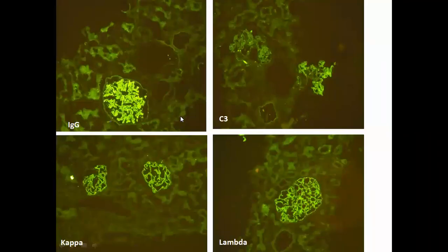And in immunofluorescence, what you will find is very strong IgG. There will be C3, which will not be as strong as IgG. It could be trace. You can just see this. This glomerulus is absolutely negative, and this glomerulus is showing 1+ kind of staining. So C3 is either negative or it will show trace to 1+ staining.